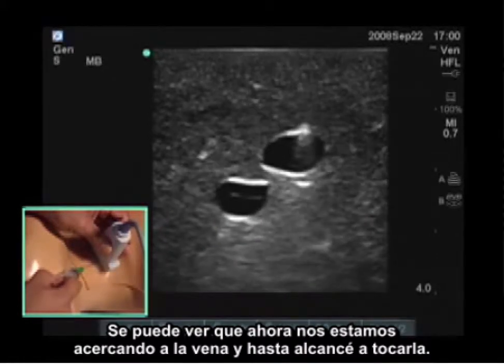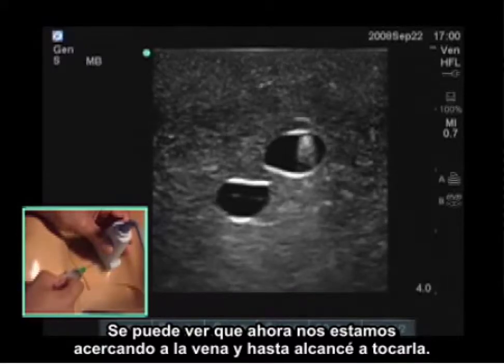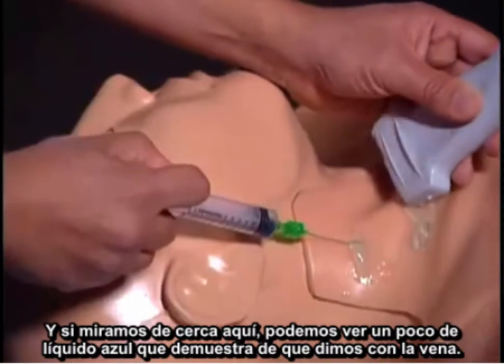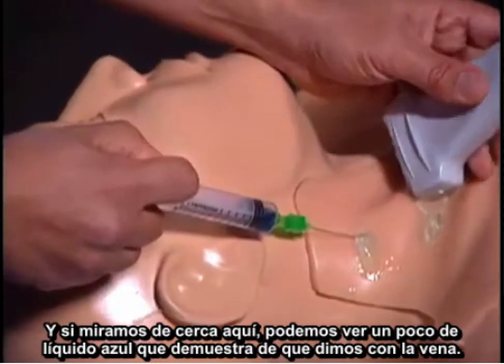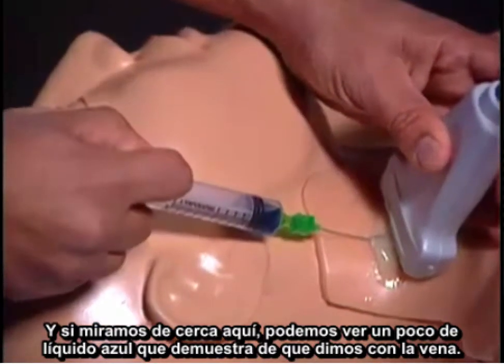And you can see I'm getting closer to the vein now. And I've actually hit the vein. And if you can get a close look here, you can actually see a little bit of blue liquid here, which demonstrates that I've actually hit the vein.